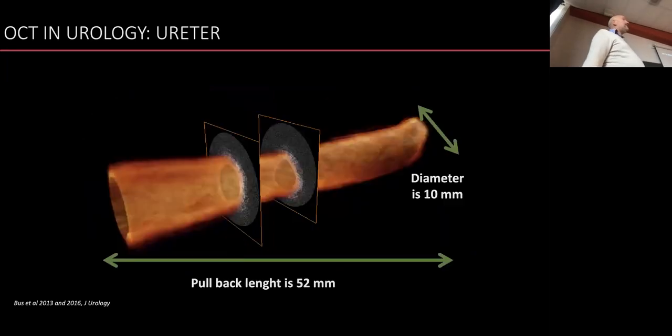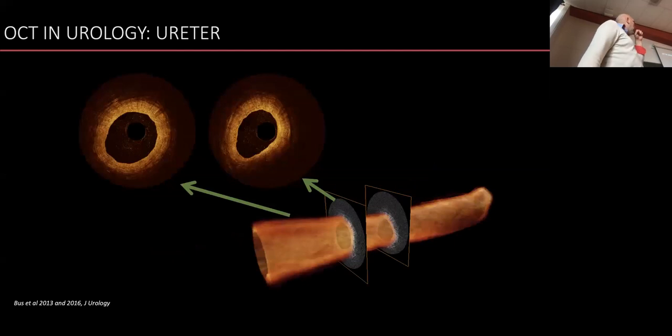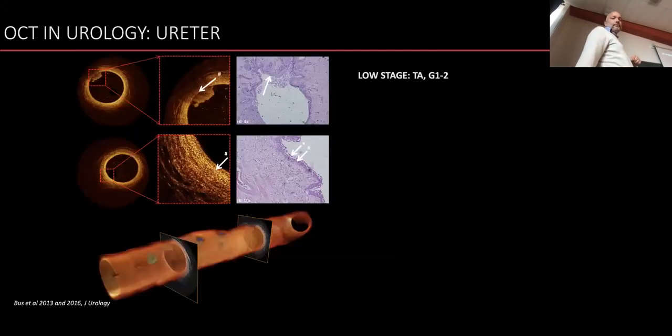What you get is similar to a coronary artery. Of course, the whole scanning mechanism is the same. We build up a scan of about 5.2 centimeters. We have 540 images over this range, so every 100 micrometers there's an image. And we can study the tissue like this.